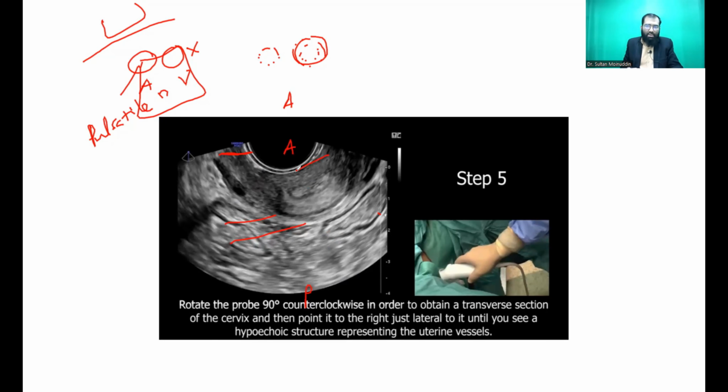So like you see, this is the uterus or this is the cervix, and this wall is the anterior wall, and this wall is the posterior wall. Can you see this? So this would become the pouch of Douglas area, and this is the rectum. So this lies in the posterior part. You have to be very careful when you are deciding which is the side. Now the probe should be oriented such that the eye is facing upwards. This is very important. Chalo.